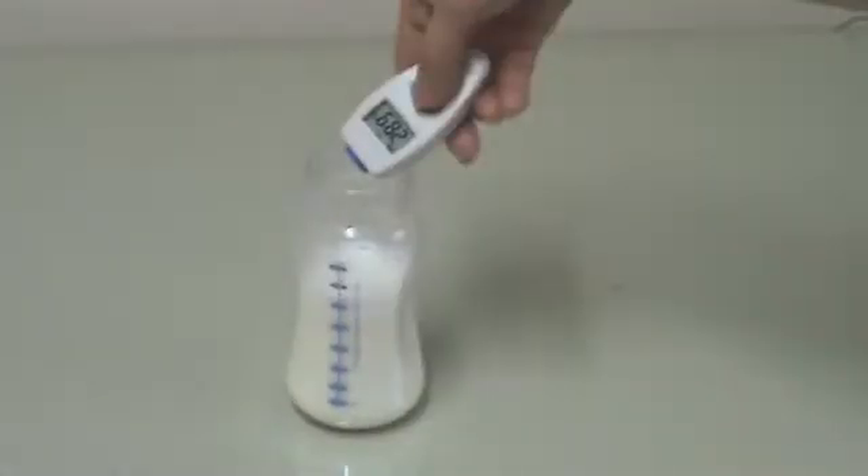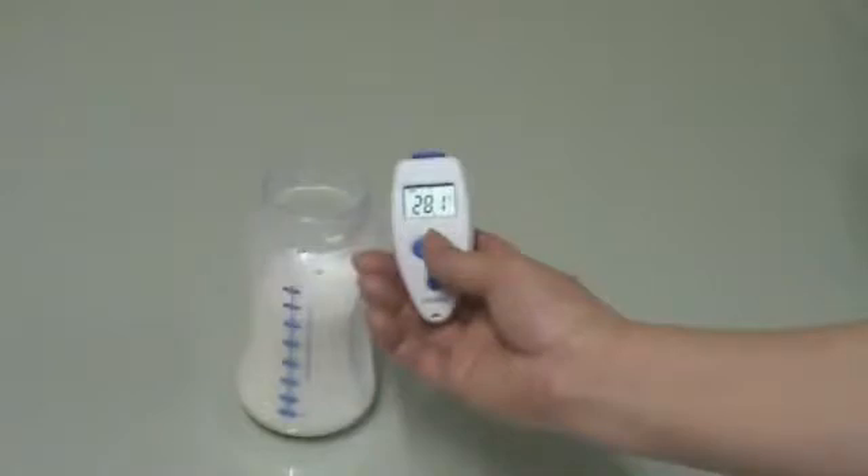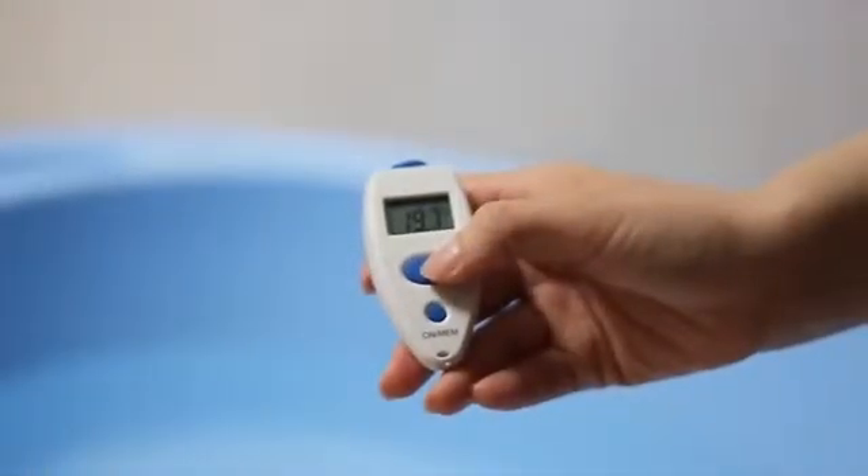In scan mode, you can scan the baby's milk or scan the baby's bath water.